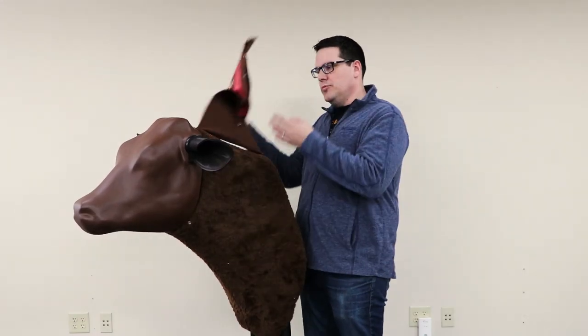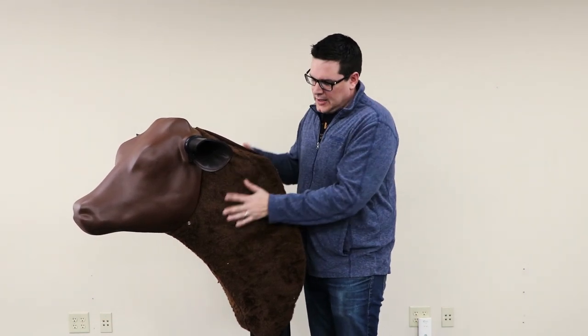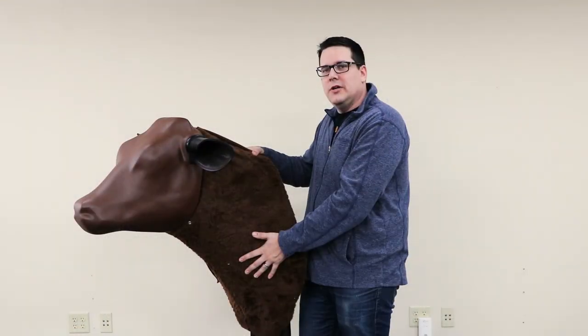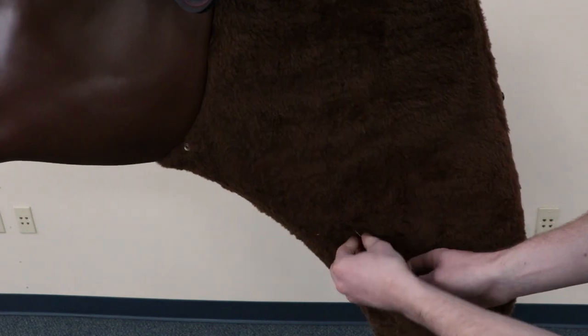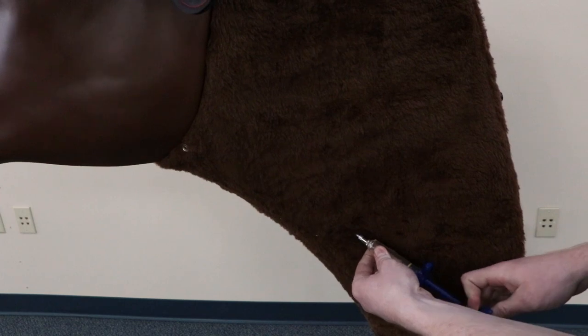I can remove this cover here and actually do injections on both sides of the animal. I can also feel the jugular here, and there's a fluid bundle that allows you to actually feel the pulse of the jugular before you do any withdrawal — it has water going through here so I can actually withdraw the liquid there as well.